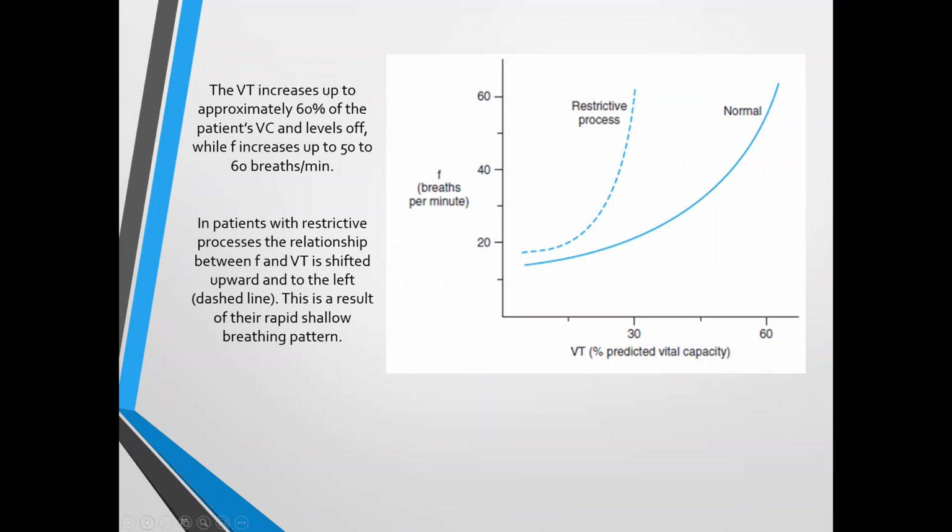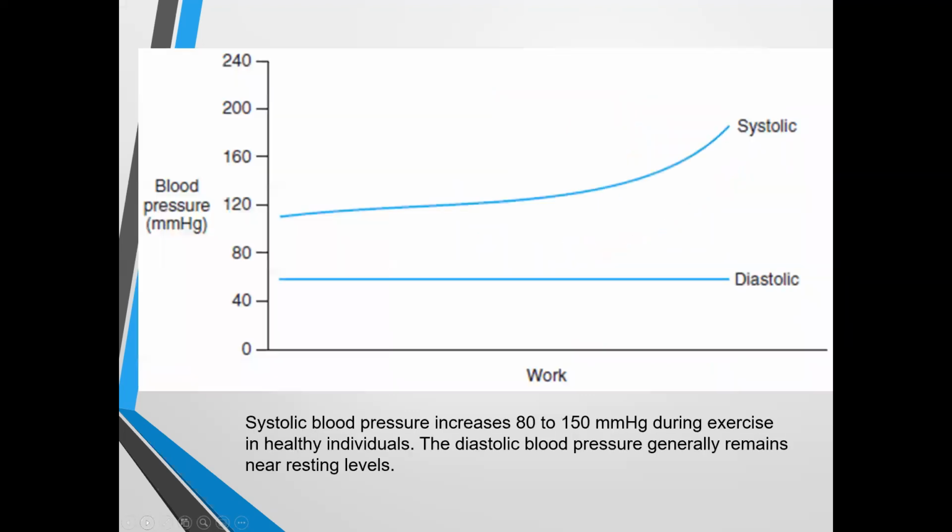Individuals' tidal volumes can go from 500, and then during the peak of the test can be multiple liters, 3 liters type thing. Like, who has a tidal volume of 3 liters? Well, an individual who's at the upper end of their exercise stress test, nearing the highest level of exercise load that they're going to have, it can go up demonstrably. That's what this graphic is showing you.